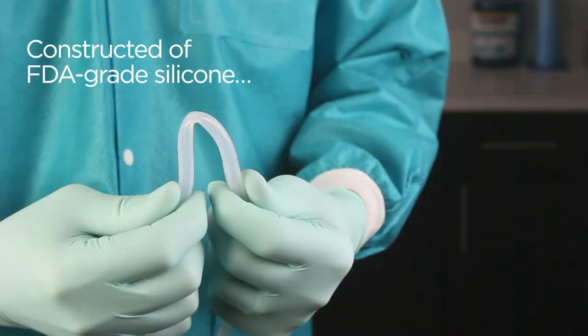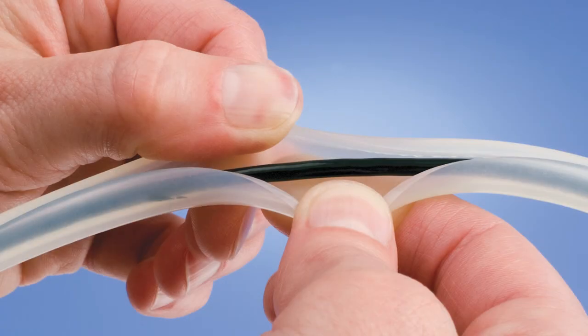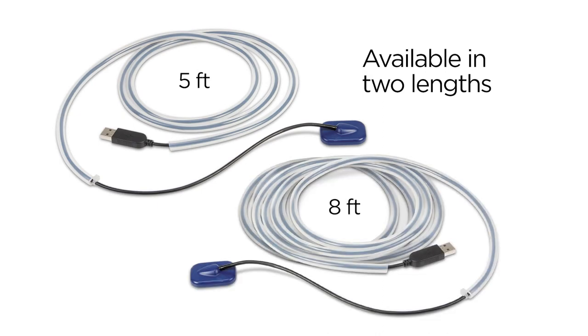WireGuard is constructed of FDA-grade silicone and withstands most disinfectants. A slit down the entire length of WireGuard permits quick and easy installation over any small cable. And WireGuard is available in two lengths that are easily cut for specific needs.